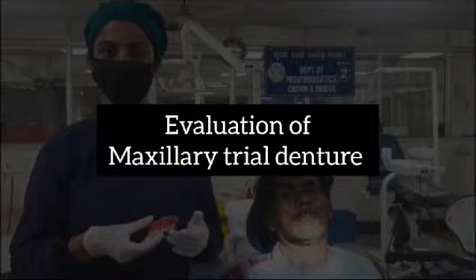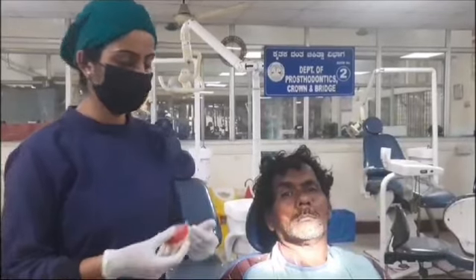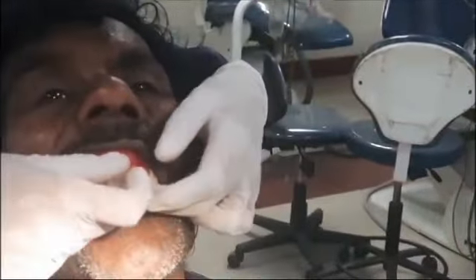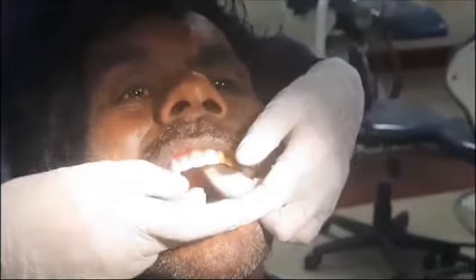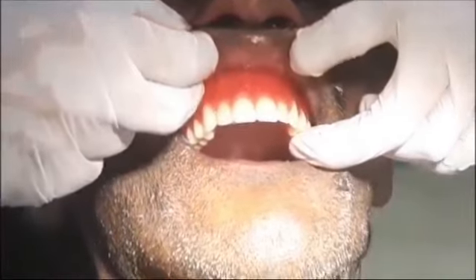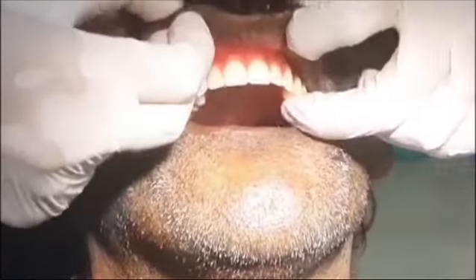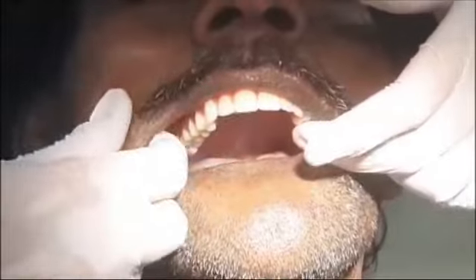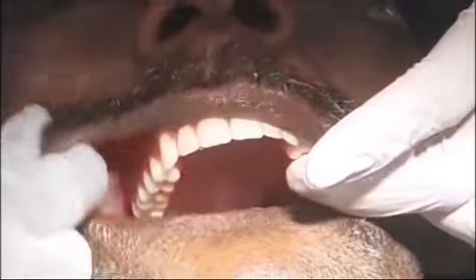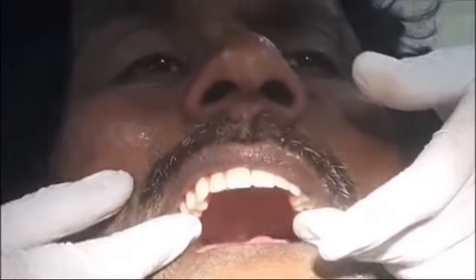Evaluation of maxillary trial denture. The maxillary denture is evaluated individually for the following: peripheral outline including posterior palatal seal, stability and retention. Peripheral outline including posterior palatal seal, buccal and labial borders are checked by moving the cheek downward and inward, simulating chewing movements. Overextension in the distobuccal flange area is evaluated by asking the patient to open the mouth wide. Underextension is evaluated similar to the lower denture.